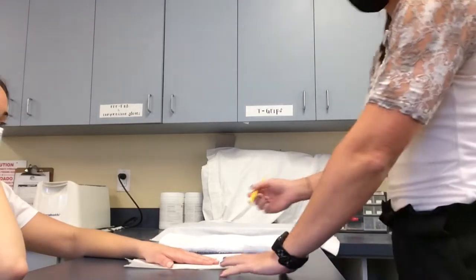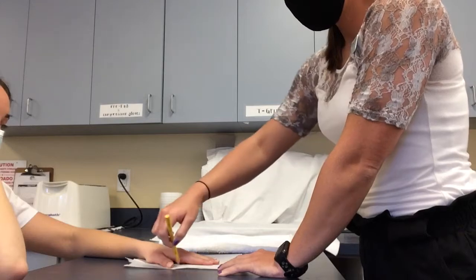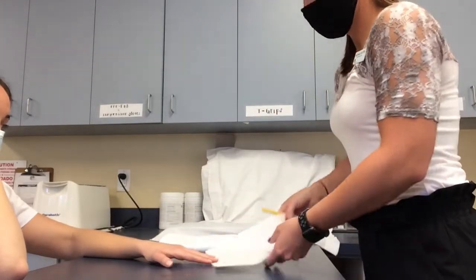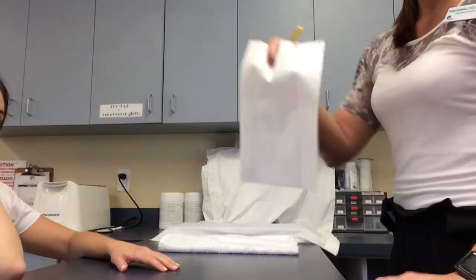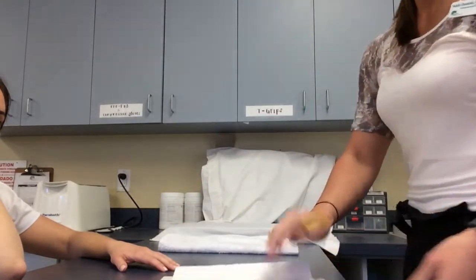First, trace the patient's hand over the paper towel to give yourself a pattern if needed. Place the paper towel over the thermoplastic and trace again. Once traced, you can place it in the hot water to heat it up, then remove it from the water to cut out your pattern.